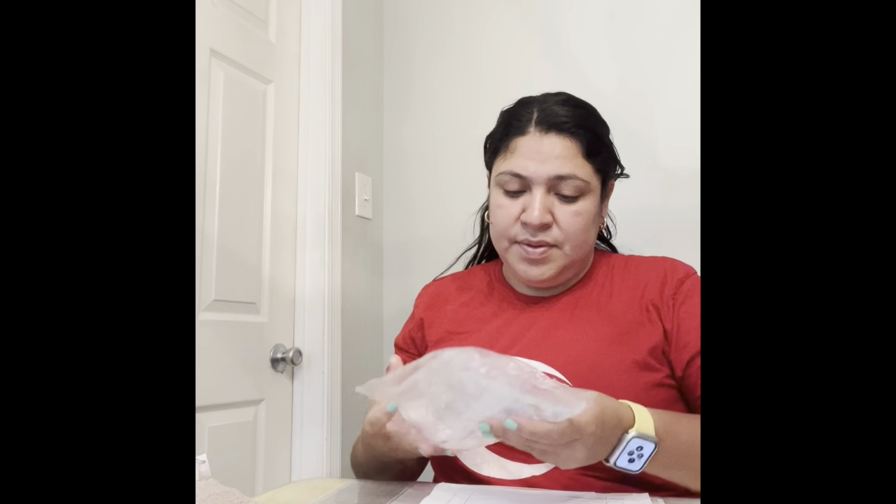So I'm going to grab all my supplies. I have hand sanitizer, alcohol wipes, and my medications, and my tubing. So I'm going to recheck. I have sodium chloride, 500 ml. Sodium chloride 500 ml to be administered 15 drops per ml tubing every 4 hours. Total is 31 drops. Time is now. I have my 15 drops per ml tubing.